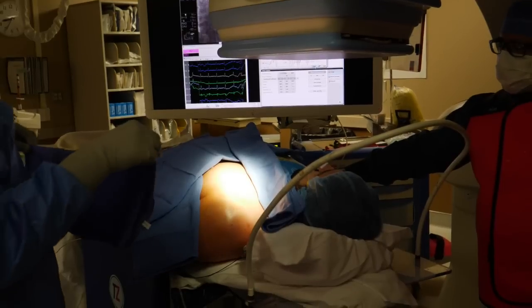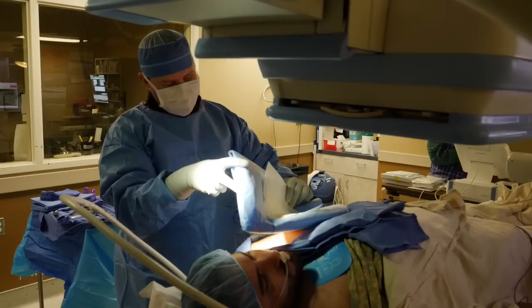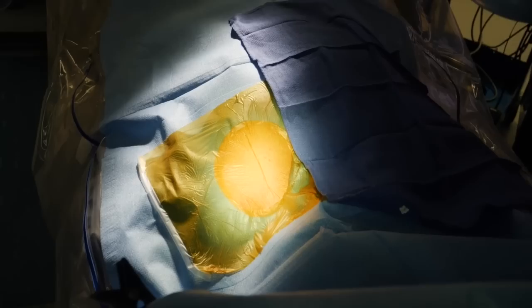This is a pacemaker implant. We begin with a sterile prep of the skin, surrounding that sterile preparation with sterile blue towels to create a very sterile working environment. The patient gets covered with a total body sterile drape, all to minimize infection. The sterile ioban patch then goes directly over the skin, and we will be working through the ioban patch.